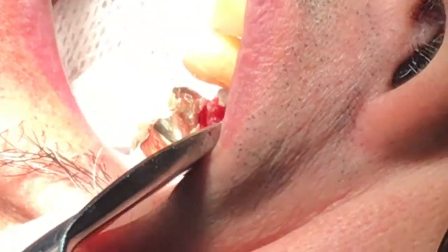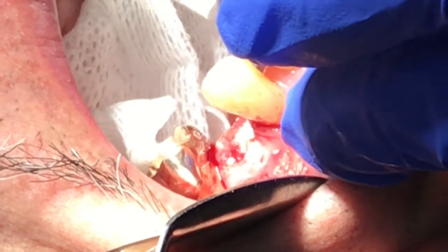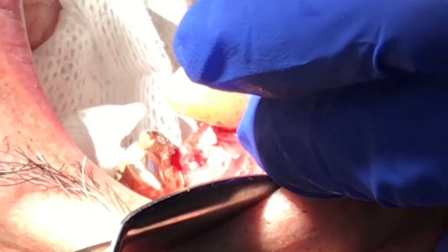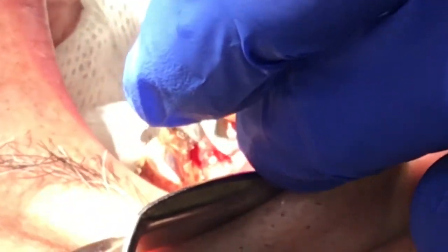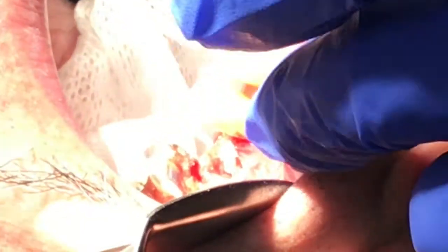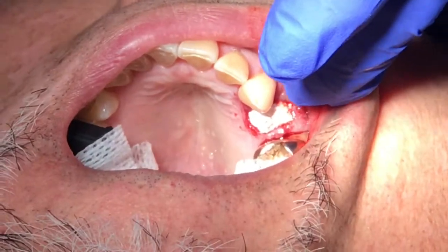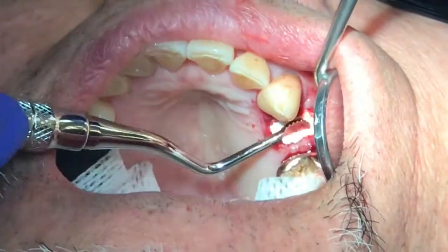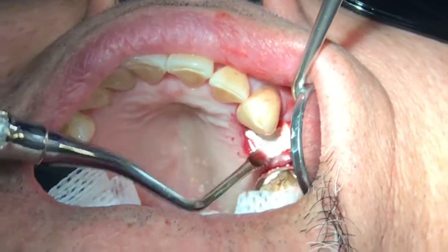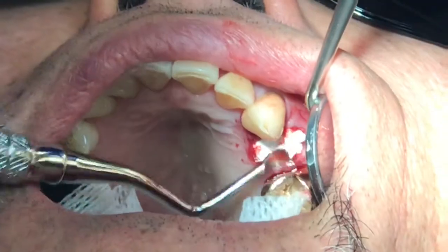If you have a stay-plate to put in, you don't have to suture as much. But if you don't have a stay-plate or any kind of replacement like a temporary bridge, you should suture really well — using several horizontal cross-suture techniques across the socket — to make sure the material stays in the socket and preserves as much bone as possible.